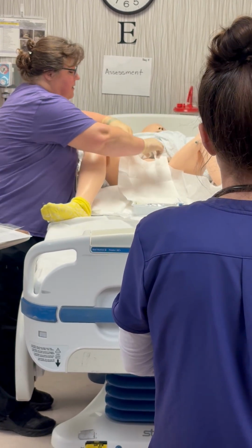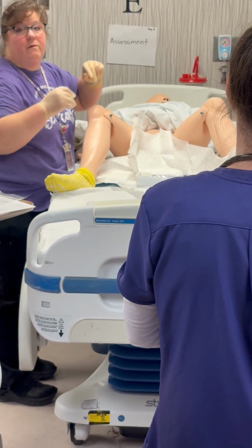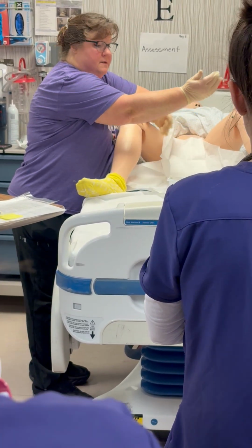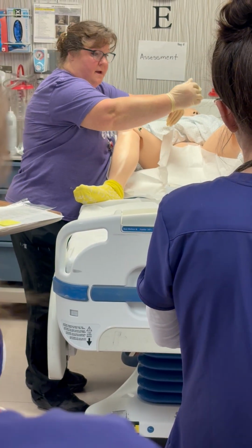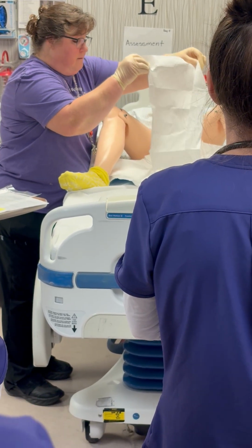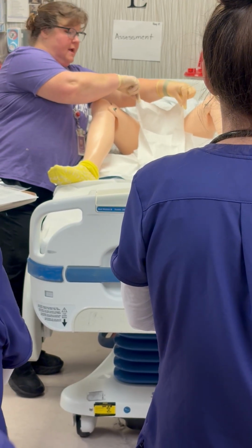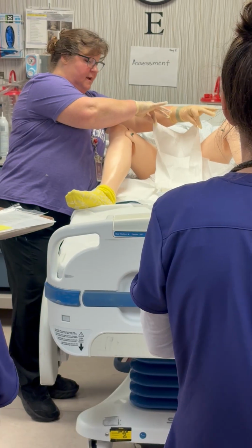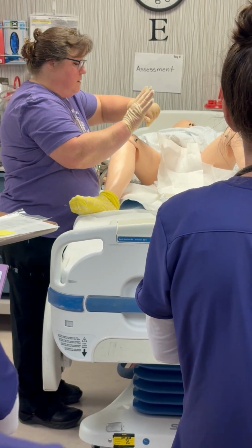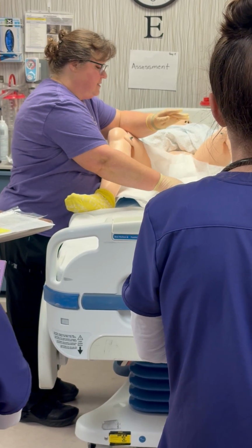Why am I not doing it like this? Why can't I do it like that? Because my arm is over my sterile field. Is my arm sterile right here? No. Okay. So that's why we say, open this up, okay, and back it in. So both your hands are behind. And then make sure you're not touching anything, and you drop it. You can fix it later, all right? Then I can take this and put it over the top of that, okay?